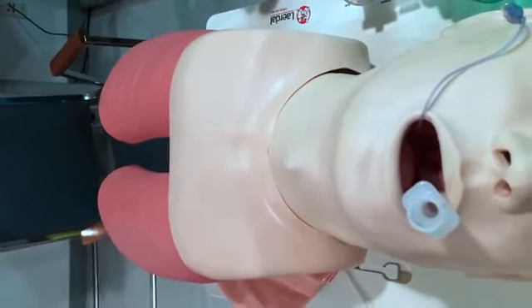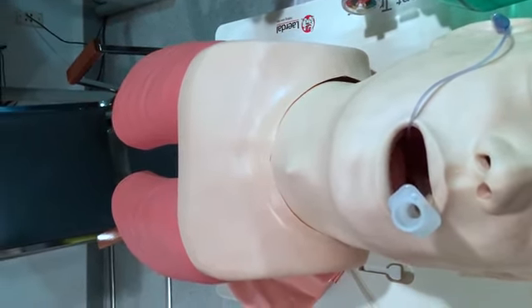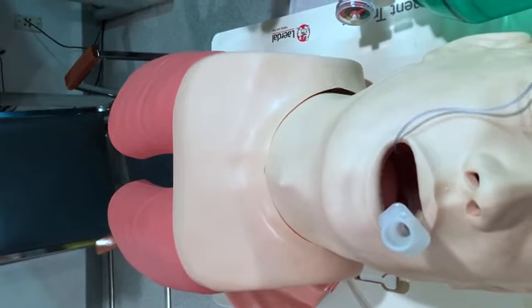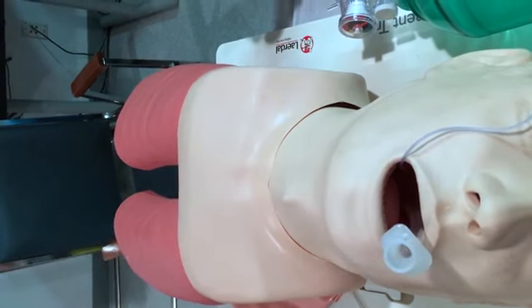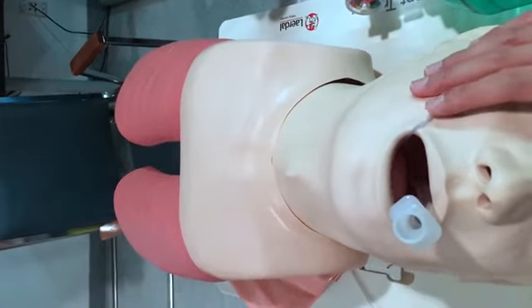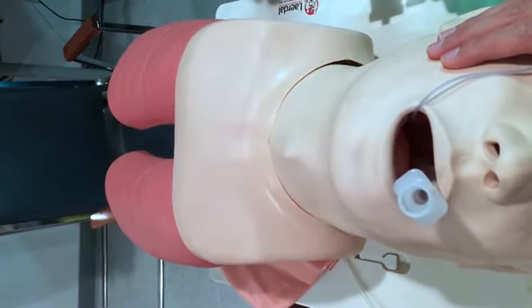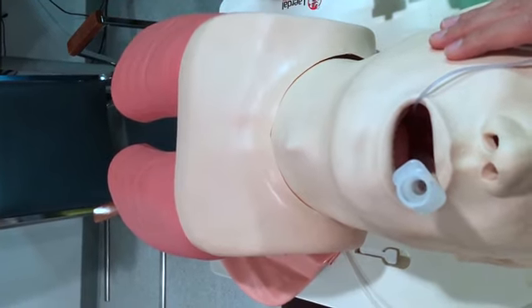So you want to identify the depth of the ET tube and evaluate peak airway pressure. If you are a little bit too deep, you want to deflate the cuff, adjust the ET tube to appropriate depth, then reinflate the cuff with minimal occlusive pressure, so 25 to 30 centimeters of water, and then verify bilateral breath sounds and continuous EtCO2 waveform. So this is one of the mistakes that can happen when you intubate a patient. You can fix it, but it's really important that you identify it, especially with uneven breath sounds and by looking at the depth and the peak airway pressure.